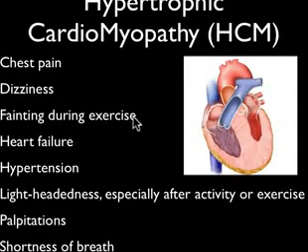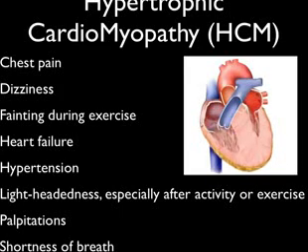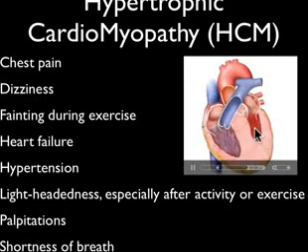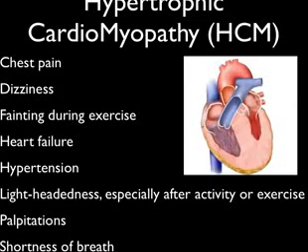So with hypertrophic cardiomyopathy, what happens is the septum of the heart gets very thickened, and once it gets thickened, it gets harder for the blood to get pumped out the aorta. And you can see, in fact, this blood here doesn't even get out the aorta. Once the patient's exercised and this gets even a little bit enlarged, the blood can't get back out that aortic valve. And so what you can do is, once you make the diagnosis, you can come in and inject alcohol in here, and that shrinks down that interventricular septum, thereby making it easier for the blood to get out the aortic valve. And the whole trick is picking up the diagnosis.